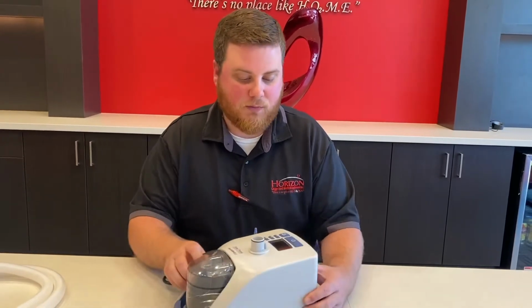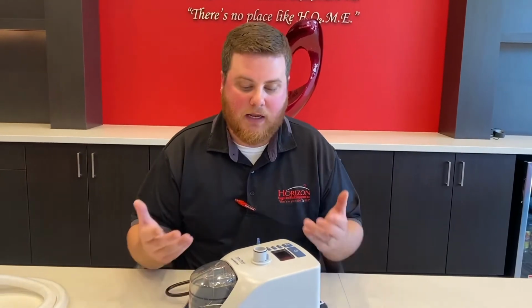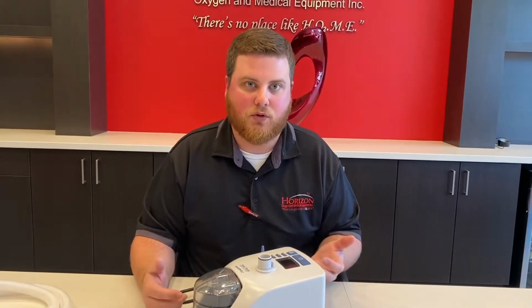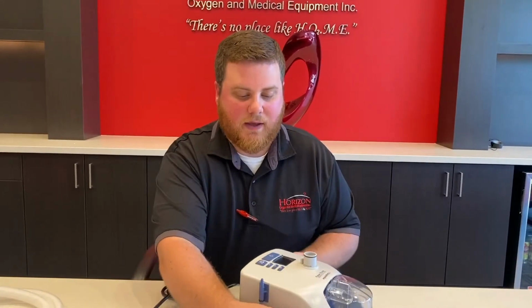Then the bulk of the machine, what you see back here, is the flow generator. Now on the Airvo, we can provide up to 60 liters per minute of flow to a patient. Not only that, I mentioned earlier that we can provide a precise FiO2, or oxygen concentration level, to a patient. And right on the side of the machine is where we would set up our oxygen source or oxygen tubing.